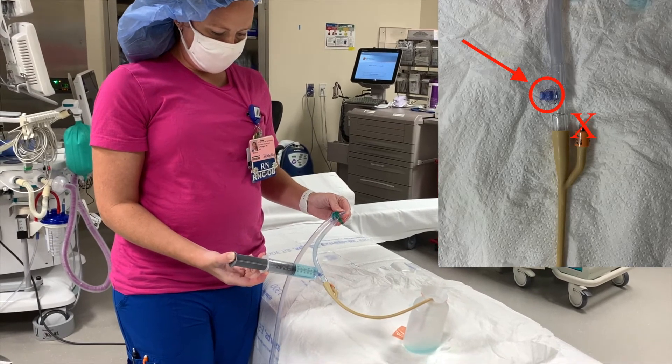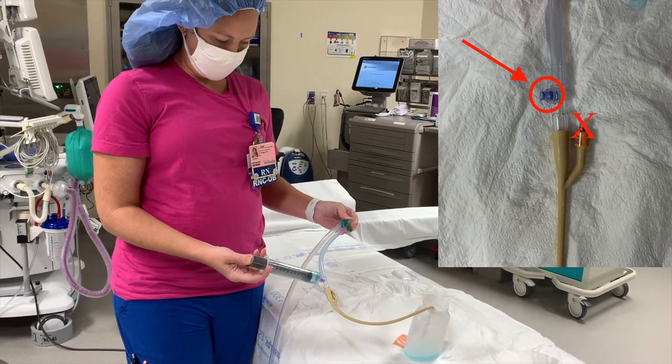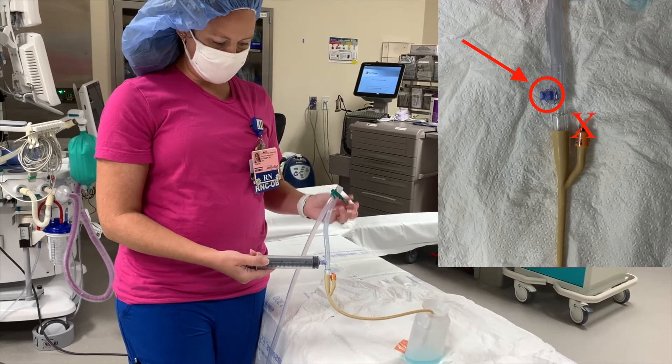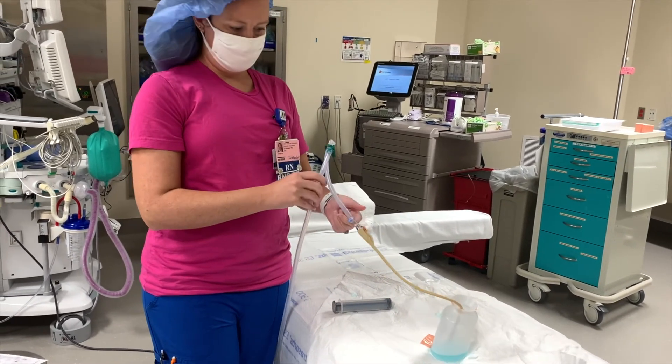The amount of fluid that you use will be dependent on what the physician wants, based on the case. Once the physician is satisfied that there's no bladder trauma — or that there is bladder trauma — they'll say that's enough, and then you're good.